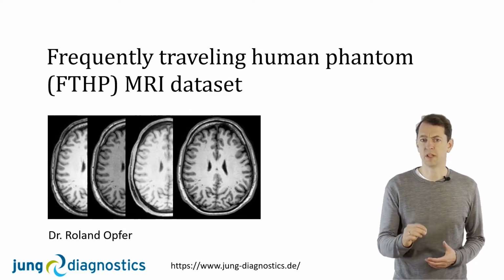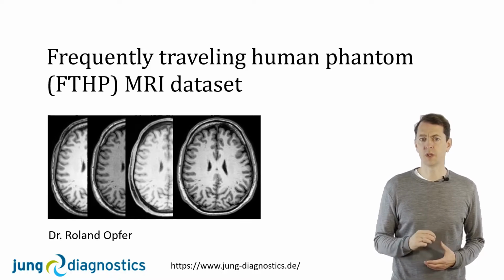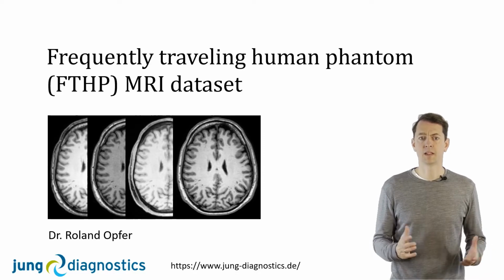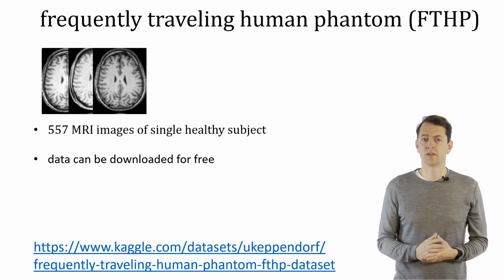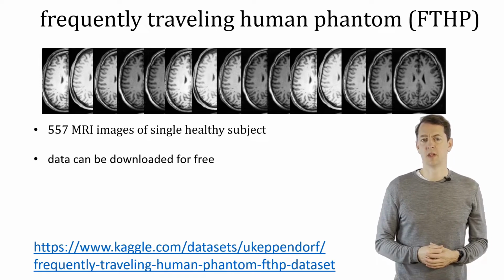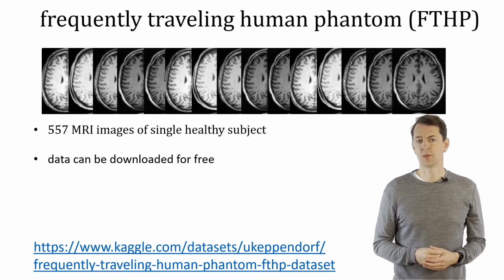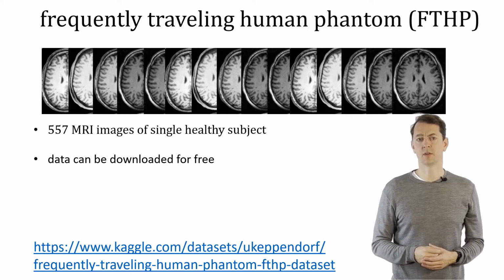This is a very special video because together with this video we will release the frequently traveling human phantom dataset. Let me explain what this dataset is about. During the last years, a colleague visited a great number of radiology centers, and during each visit the brain of that person was scanned with an MRI using a 3D T1 weighted gradient echo sequence.